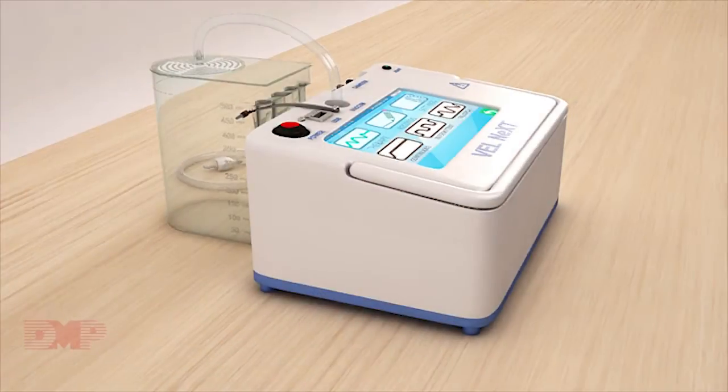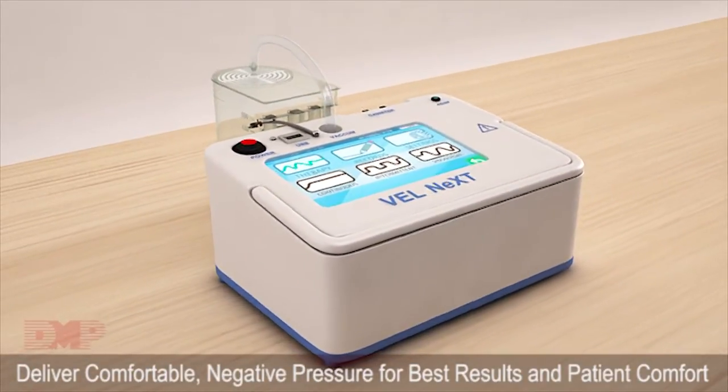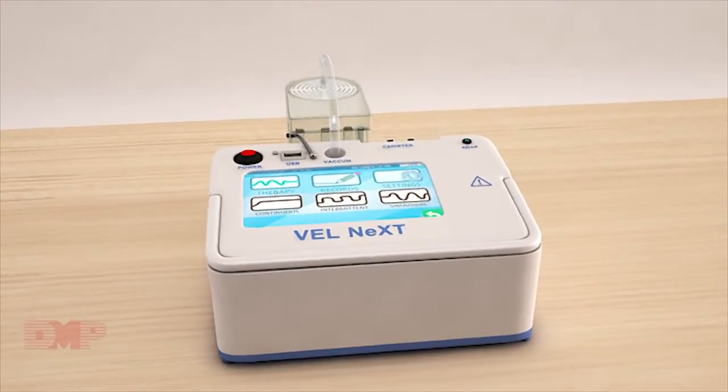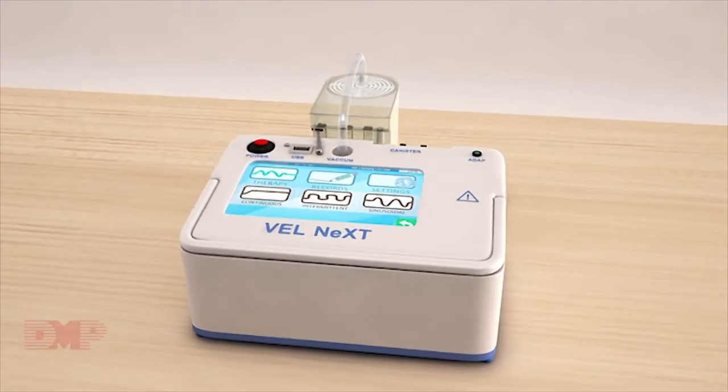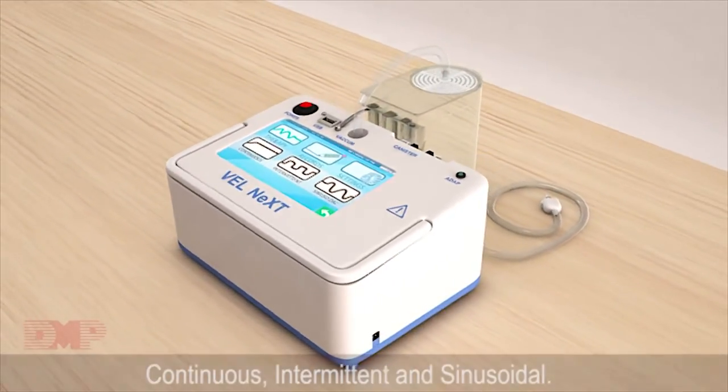Velnext Technology is engineered to deliver comfortable negative pressure for best results and patient comfort. Velnext has outstanding capacity to work on three different forms of therapy: Continuous, Intermittent, and Sinusoidal.